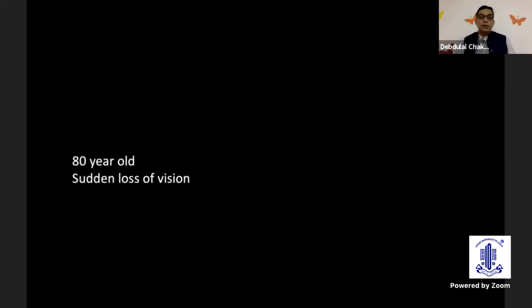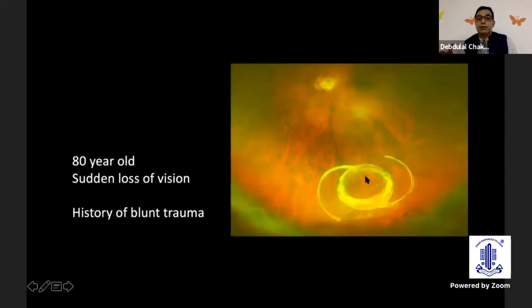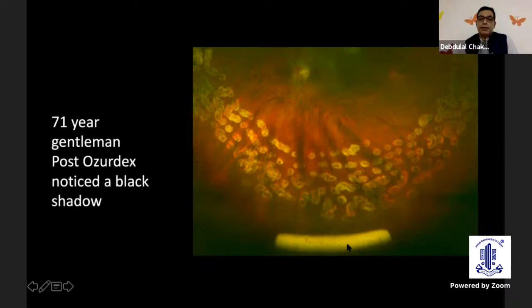So this is an 80-year-old with sudden loss of vision and with a history of blunt trauma. And we could show him this IOL that had dropped inside the vitreous cavity and was lying on the retina, and that could explain to him what made him lose his vision. There was this 71-year-old gentleman post Ozurdex who noticed a black shadow, and he came running to us, and we could show him the Ozurdex right in the inferior periphery, and he was kind of satisfied, and he understood that this was not something very serious.